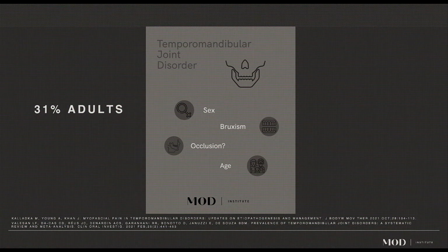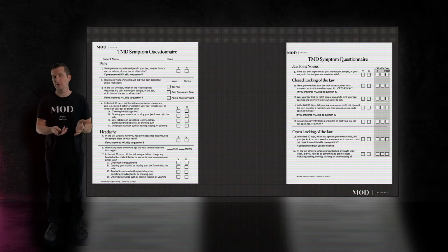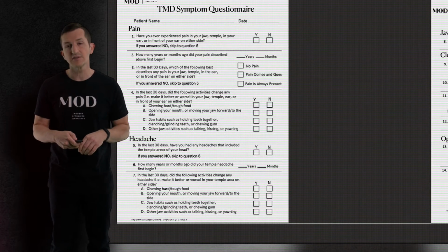And so there's a few ways for us to look at a comprehensive process for assessing temporomandibular joint dysfunction. One of them is symptomatic questionnaires, but we know that sometimes patients aren't the best historians. Maybe the symptoms were a long time ago and they've adapted and they've forgotten. Maybe it was below the level of what they would really consider needs to be reported to you as a provider. There's certainly things that can be missed with these symptomatic questionnaires.